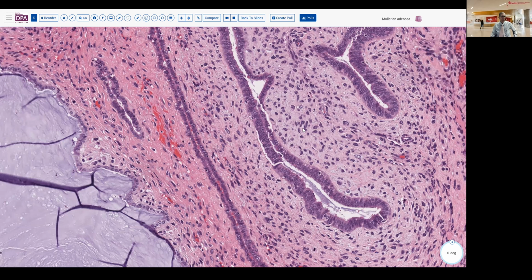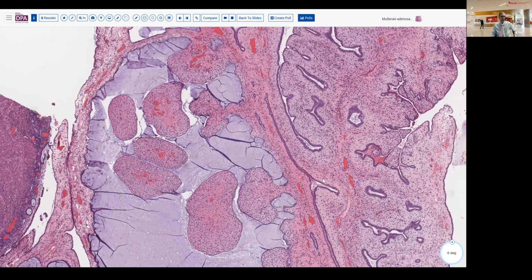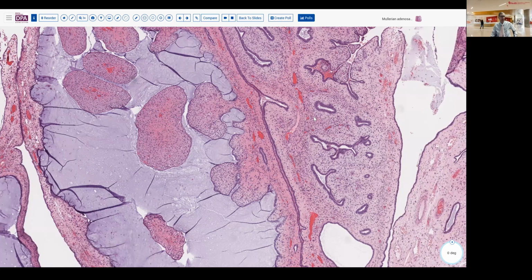So these can be somewhat deceptive in a variety of ways, both on the low-grade side of things and, as we've just witnessed, in a higher-grade sarcomatous overgrowth area, where there probably was a long-standing lesion of this sort that then dedifferentiated and became very hyalinized and fibrotic over time, leading to the misinterpretation as a placental site nodule.